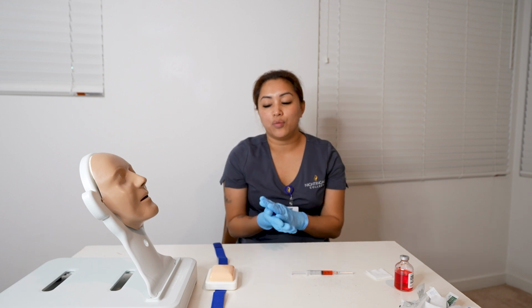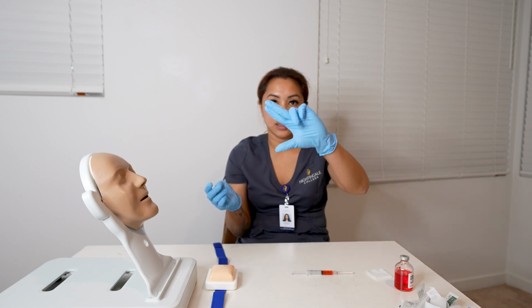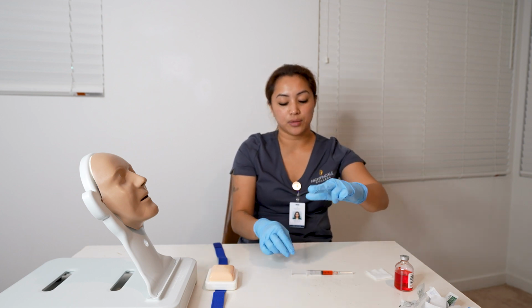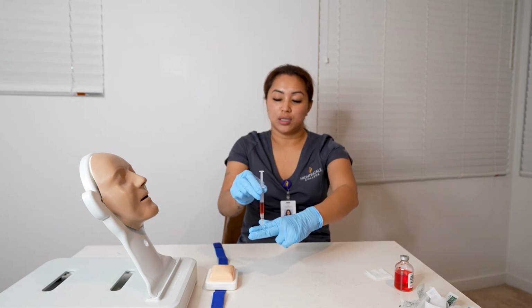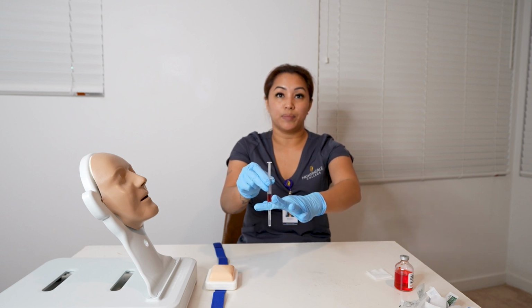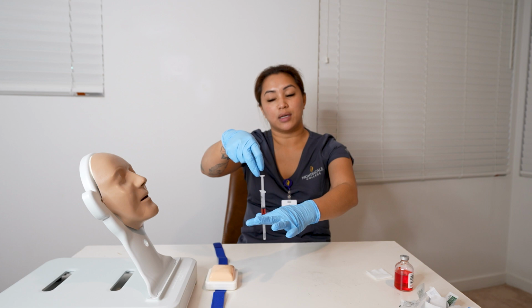So now while we are letting it air dry, I'm going to spread the skin with my non-dominant hand like this again. And this is where her deltoid would be. Spread it tightly. So then now I would get the syringe at a 90-degree angle with my dominant hand, and I will just inject it like so. So and then I would hold the syringe barrel with my non-dominant hand, and then I will pull back just 5 seconds just to see if I am in the deltoid muscle.